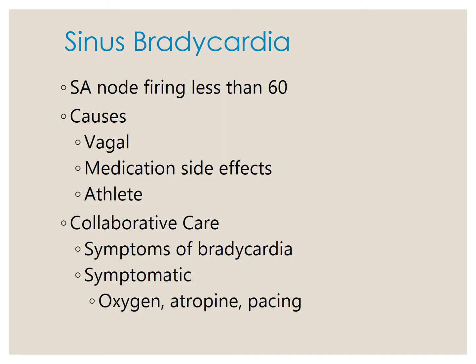Sinus bradycardia. This is where your sinus node is firing regularly at a rate of less than 60 beats per minute. Again, so less than 60 beats per minute is considered a bradycardia. If there's a P wave, we know that it's firing in the SA node, and so it's a sinus bradycardia. So possible causes of sinus bradycardia, increased vagal or parasympathetic tone.